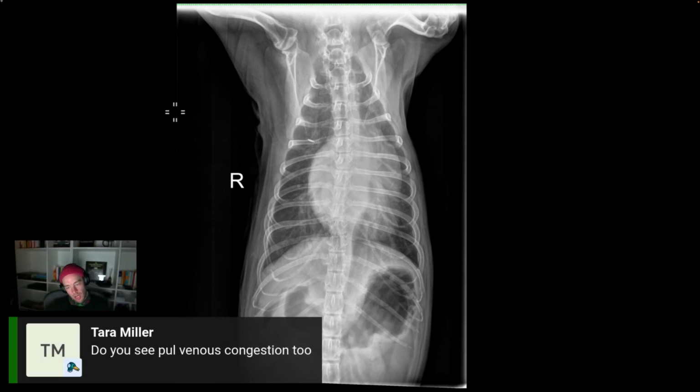Pulmonary venous congestion. I think that you've got to be careful with that. We've talked about this before, but on your end, meaning you're seeing the patient in your clinic and you're understanding what medications they've been given, you'll have a better understanding. In the teleradiology sector, it can be hard to get great histories, and so it's possible that this patient has been given Lasix.